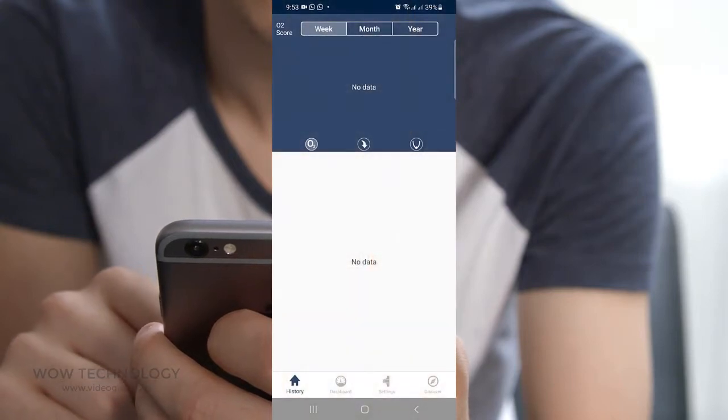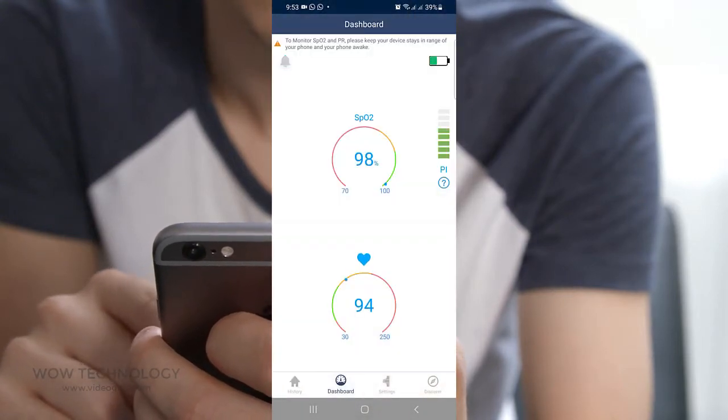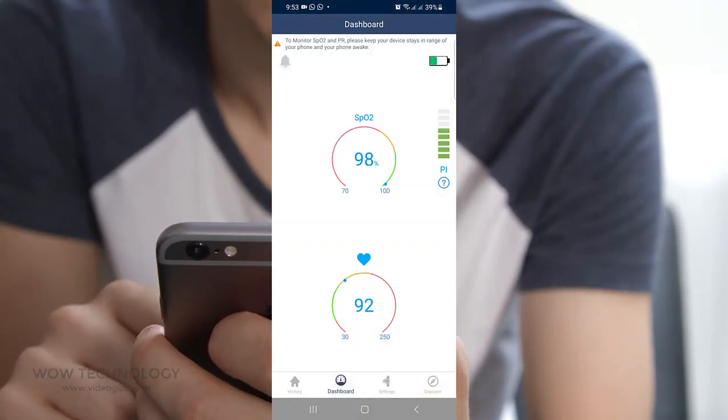From the Dashboard tab you can see blood oxygen saturation and heart rate in real time — just keep your ring near to your phone.